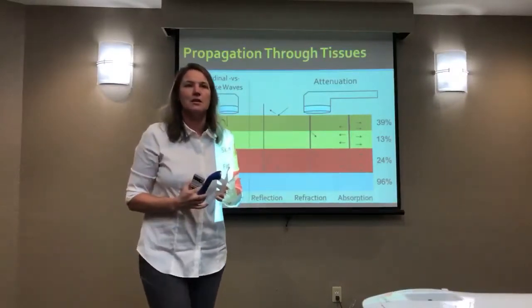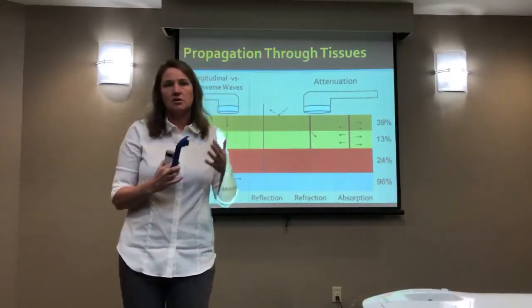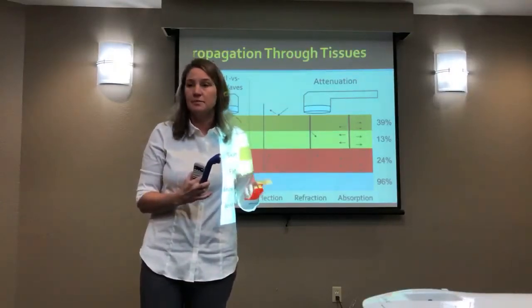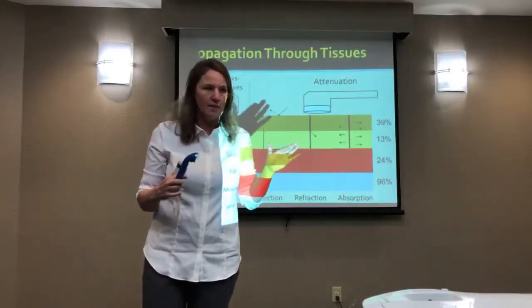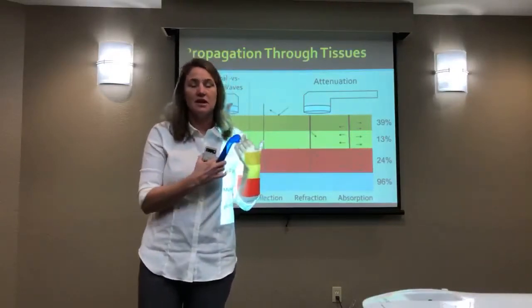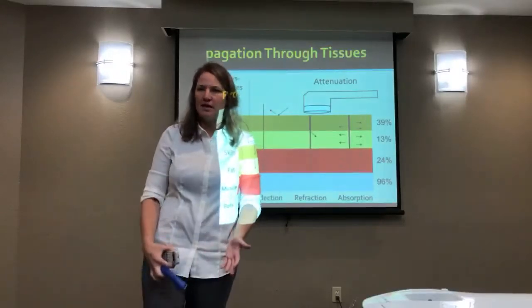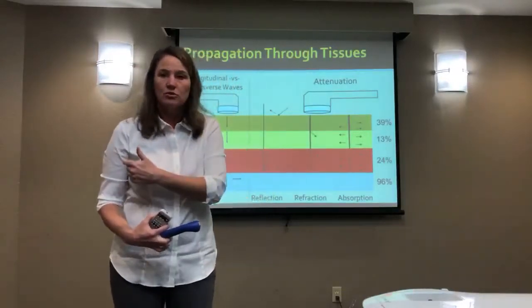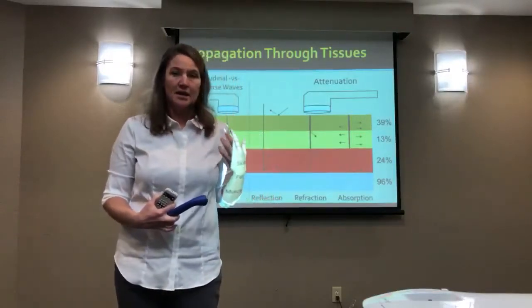That also helps if you're thinking about contraindications, precautions. If there's some target that you want to avoid, let's say they have a problem with their shoulder and they have a pacemaker. A pacemaker, unlike E-stim, which is pretty much don't put it on them at all, anywhere on their body. With ultrasound, as long as the energy itself is not going to encounter that pacemaker, you're fine. So if somebody has a pacemaker, I could ultrasound their lower body, absolutely no problem. I could be on their back, I could be on the opposite shoulder. There's no way that energy is going to travel across their body and get to the pacemaker.